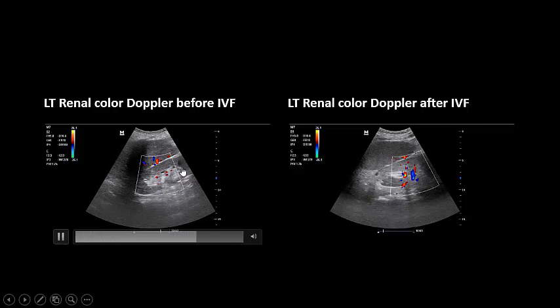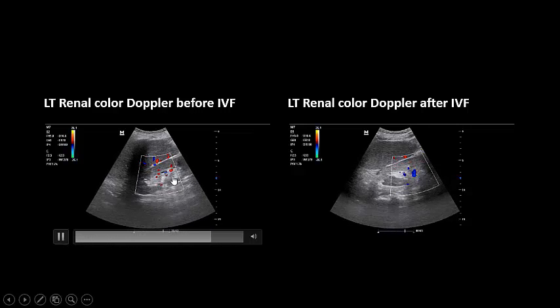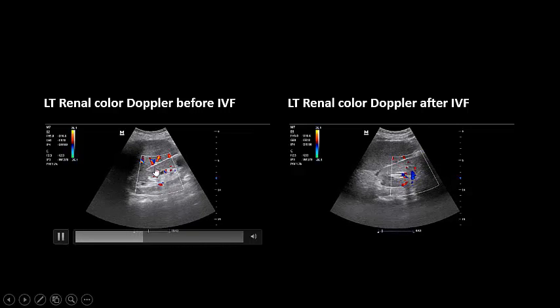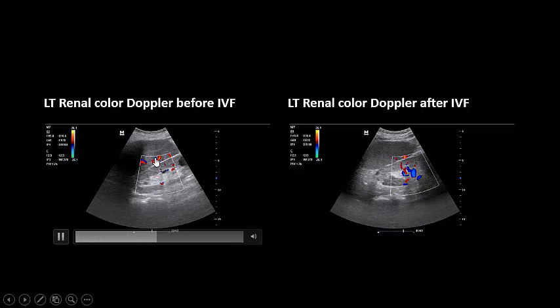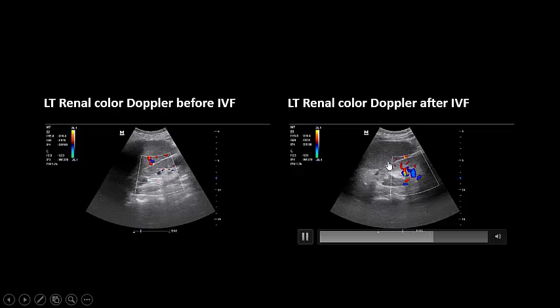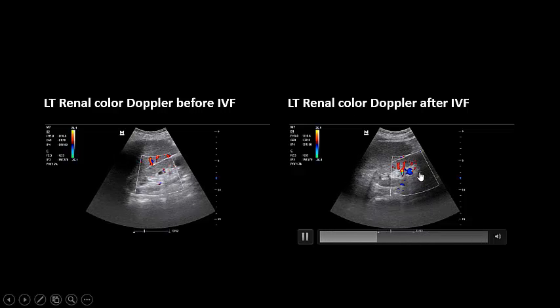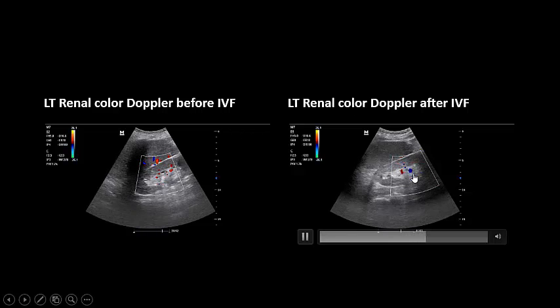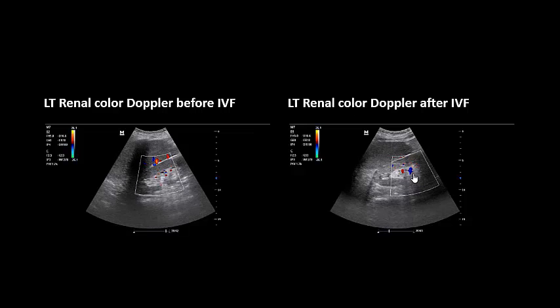This very poor Doppler flow, which is in red in the arterial system and blue in the venous system, because my probe is here. You will keep giving fluids and watching the vascular bed improve by looking at the improvement of the color flow of the vital organs. It's very easy.